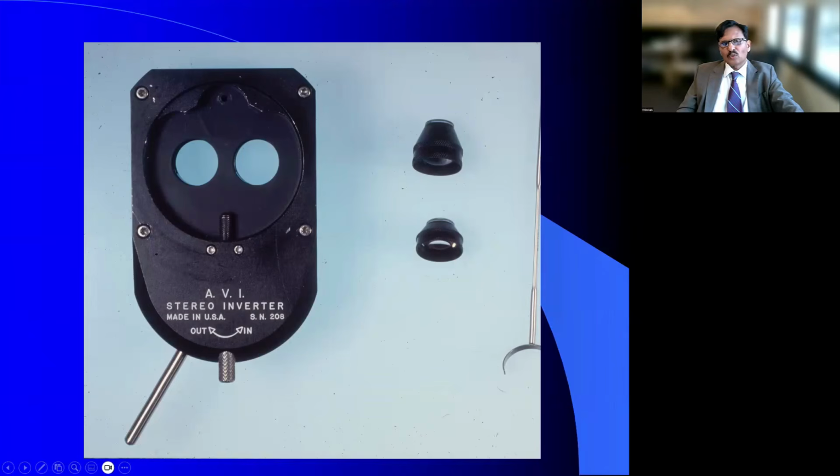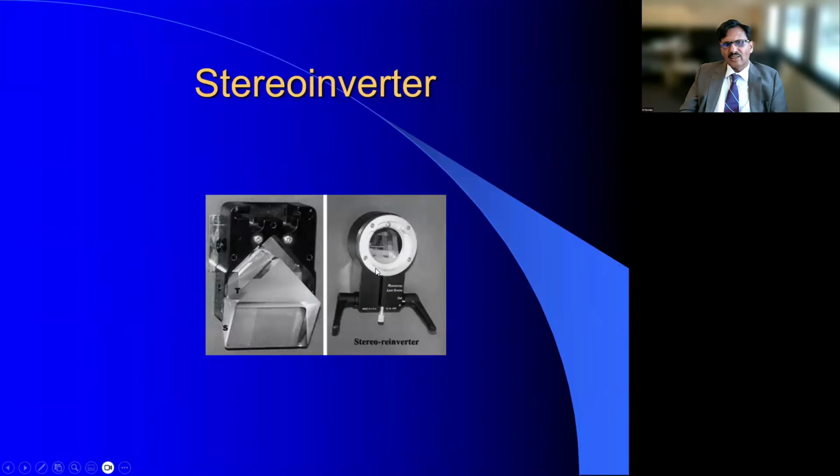This is very useful for any pathology in the equatorial region, most notably diabetic retinopathy and related traction detachments. Whereas the one at the bottom is a lot more useful for PVR cases and retinal detachment, where the pathology is most of the time located anterior to the equatorial region. And one of the problems, I'm going to go over this again in each of the systems.